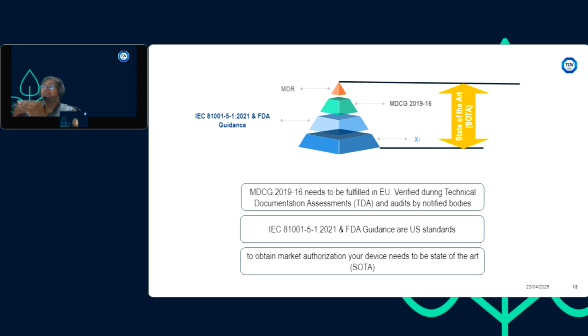So they are expecting you've thoroughly thought about the test cases, you are doing business logic analysis, you are doing scans about it, and then also it's not only up to pre-market, you have a post-market surveillance plan as well. So if you are doing this much activity, then you will fall into the state of the art level where you will be able to get the market authorization in most of the cases. Okay, now I'm mentioning most of the cases because for everyone the cases will be different in each category. And please, please think in very detail about this security, because people underestimate the attack surface, and then we get a lot of challenges while submitting these particular things.